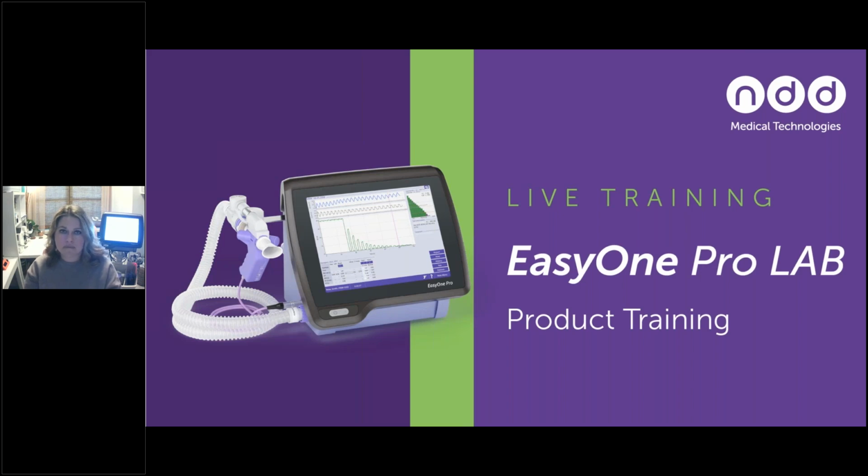Yep. We get this question a lot: what do we do about dentures? Yes. Same rules across the board for dentures, in my opinion. If they are well fitted and secure, your patient is going to be able to create a much better seal with them left in place.